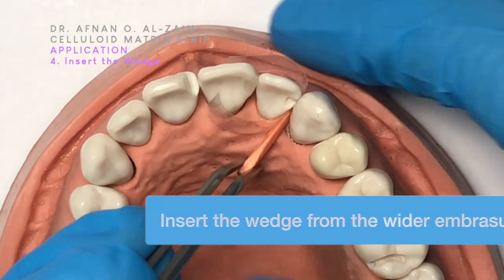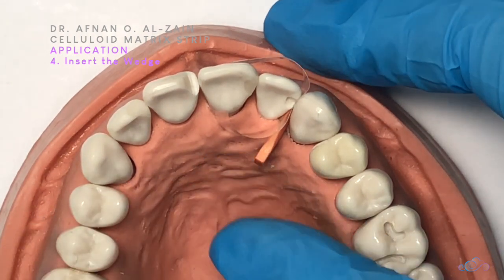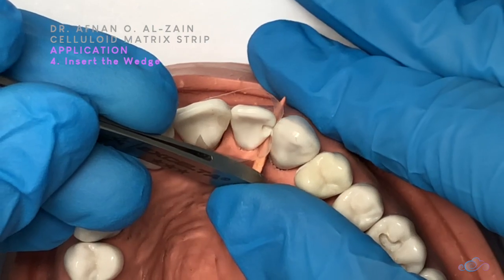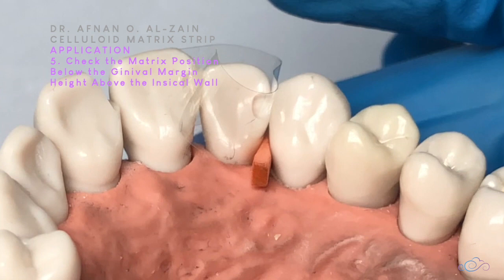We're going to insert the wedge with the forceps. Then we flip the forceps and use the back of the forceps to push it in, getting it from the other side. Next, I'll confirm that the matrix is below the gingival margin by at least one millimeter and higher than the incisal wall by at least one to two millimeters.